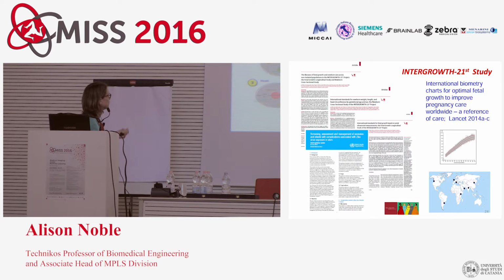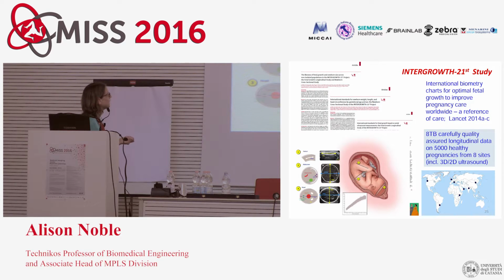I think from our point of view, this seems a little bit strange because they're all size-based, and in most other areas of medicine, you wouldn't use size as an indicator of health, but the state of obstetrics is still very much at that domain.